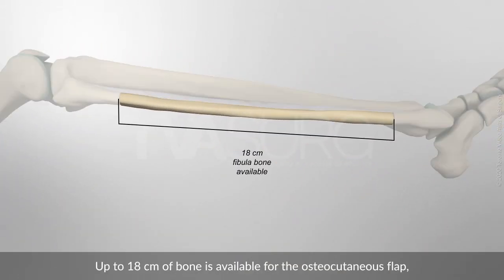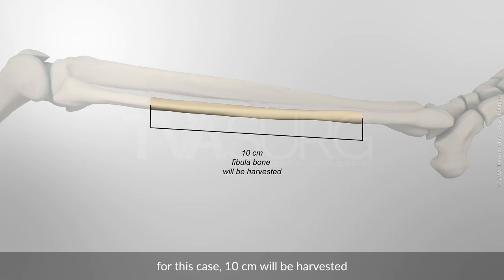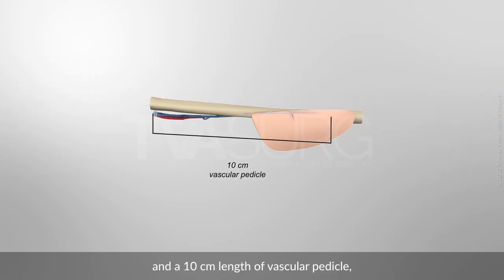Up to 18 cm of bone is available for the osteocutaneous flap. For this case, 10 cm will be harvested, as well as a 3x5 cm skin paddle island, and a 10 cm length vascular pedicle, including the peroneal artery and two vena comitans.